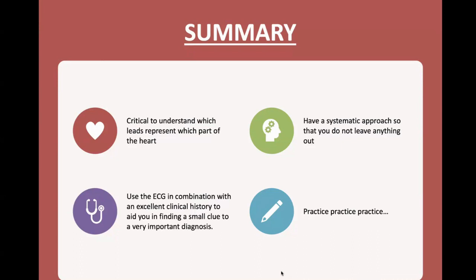Every ECG must be interpreted in the light of the clinical information about the patient, and in the pediatric age group, the age-specific limits of normal are an essential tool to accurately assess what you are seeing on the ECG.